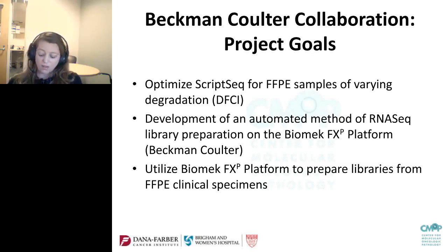For paraffin-embedded tissues in prostate cancer, typically there are two specimen collection types. There's a fine needle aspirate, and then there's core biopsies. Prostate cancer cannot be diagnosed from frozen sections due to the difficulty of the morphology, so predominantly the archival collections that we have are formalin-fixed paraffin-embedded tissues. Globally we have these large-scale cohorts where the prostate cancer clinical specimens have been archived, and in-house we have access to all of these samples with clinical annotation, including diagnosis, prognosis, etc., to help us do retrospective studies.